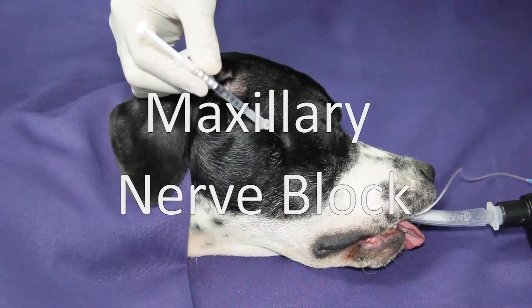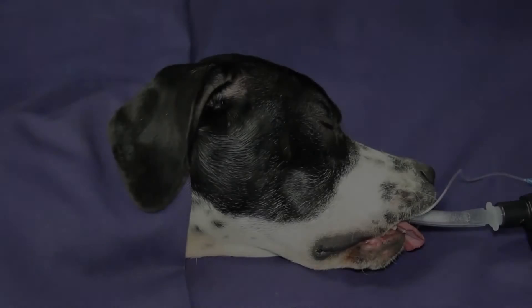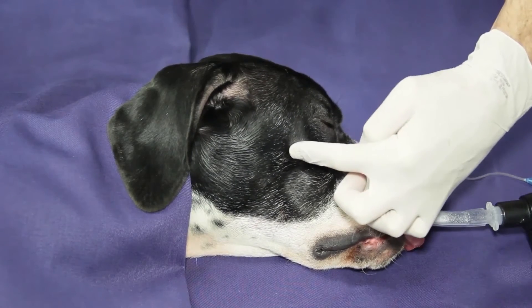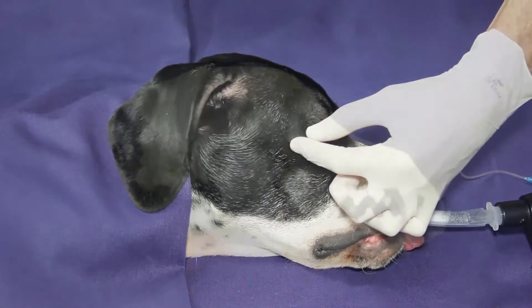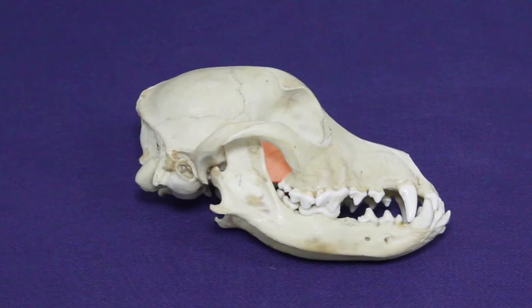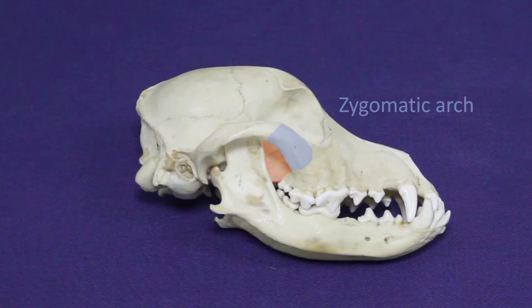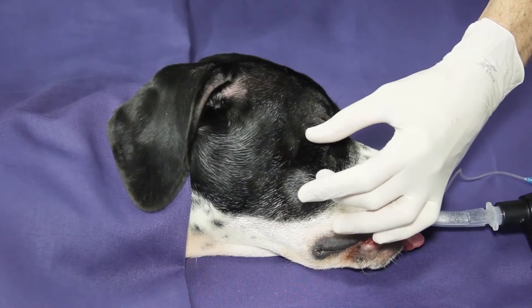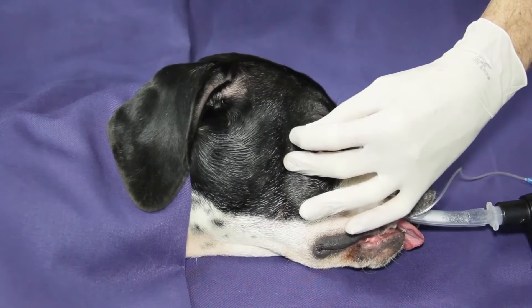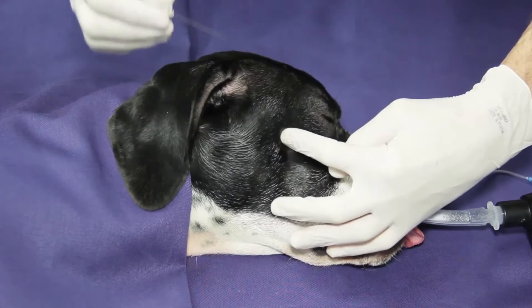The Maxillary Nerve Block. The transcutaneous approach for the maxillary nerve block involves desensitizing the maxillary nerve as it enters the pterygopalatine fossa. The nerve can be located ventral to the rostral aspect of the zygomatic arch and caudal to the vertical aspect of the maxillary bone. The needle is inserted in a rostromedial direction between the caudal aspect of the maxilla and the vertical ramus of the mandible, at the level of the junction of the zygomatic arch and the vertical aspect of the maxillary bone.